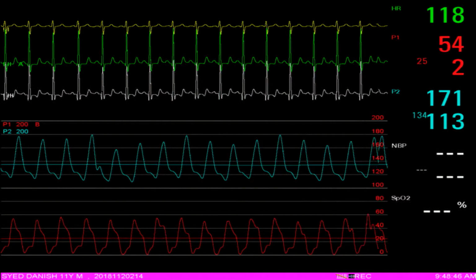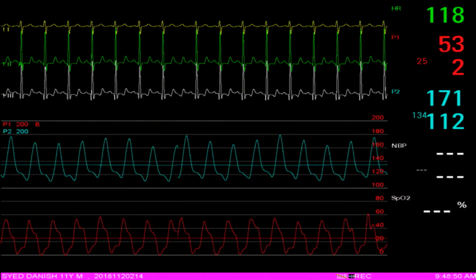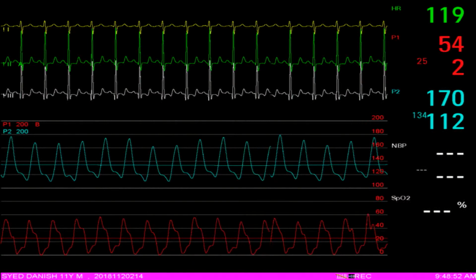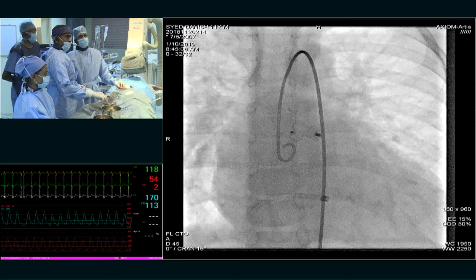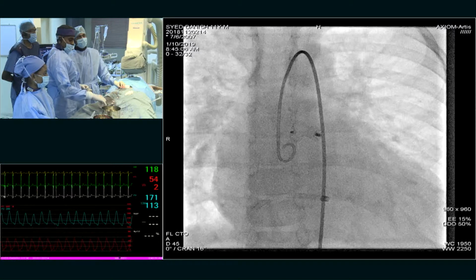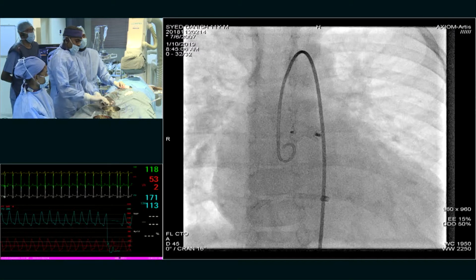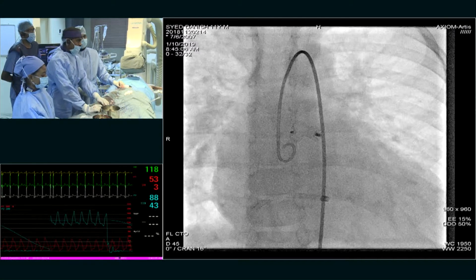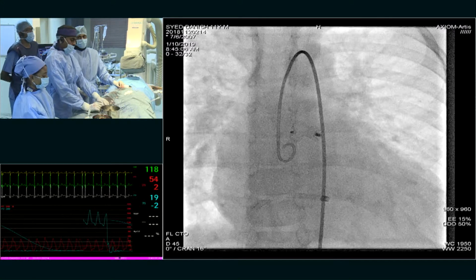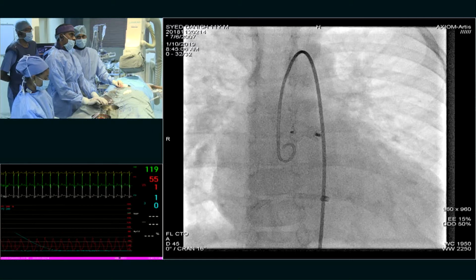So your choice will be a muscular VSD device? So then you mean it is pulled more into the PA?